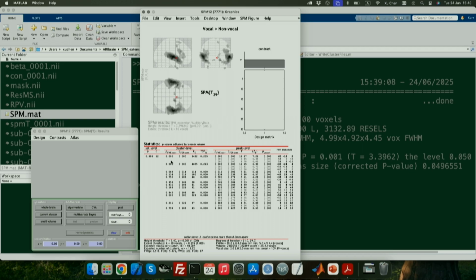If you have a closer look at the FWER corrected p-value, then you will be able to find this cluster is significant, and this one as well, and also this one. And the corresponding TDP for these three significant clusters are non-zero, while the rest of the insignificant clusters have zero TDP. So we will only observe non-zero TDP for those significant clusters based on the standard cluster inference.